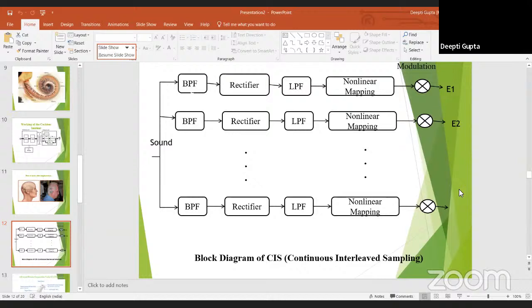So in that way, it will reach the electrodes, and from the electrodes, because they are residing in the cochlea, it goes directly to the auditory nerves, and from the auditory nerves directly to the brain. And in that way, we are able to hear because it is working in electronic form. So we can say it is mimicking the sound. It is an electronic sound, not like the normal sound we hear. So this is totally different.